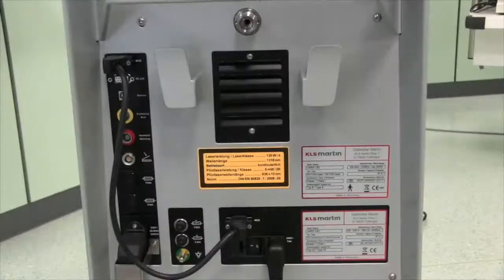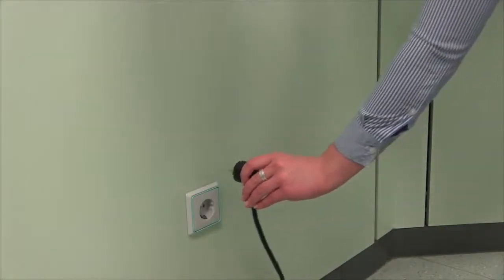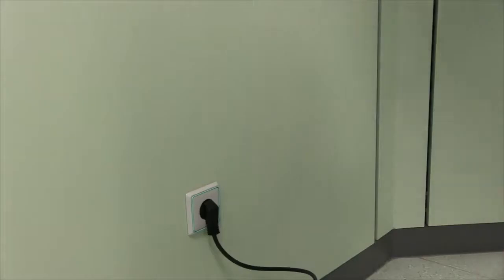Before the KLS Martin YAG laser system is used, the connections at the back of the device have to be fixed in the first step. First of all, please connect the device to the power supply system. Therefore, the mains plug has to be connected to a separate socket.